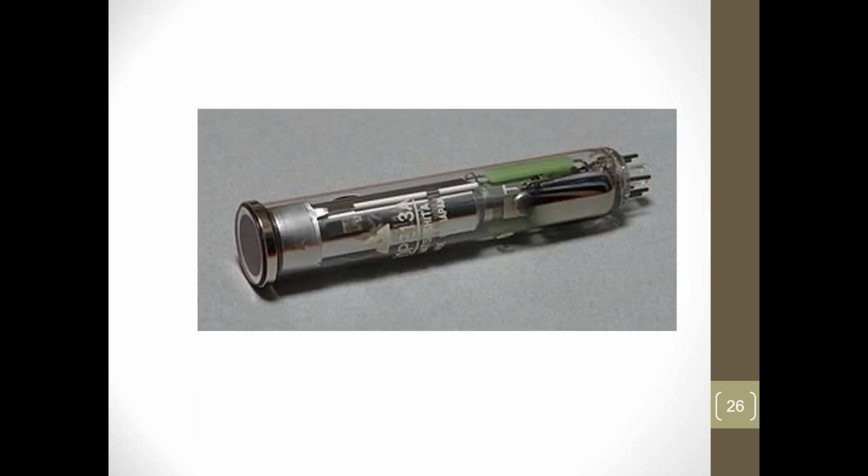Pickup tube. So the early systems used a video camera, and this is the actual tube, the video tube that makes the images. For decades, this was the gold standard of making images for fluoroscopy, at least the live ones. I want to say they probably ditched this technology sometime in the late 1990s. So it had quite a run. This would have been just at the advent of digital technology coming into the world.